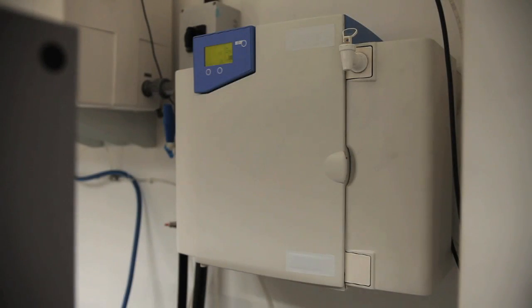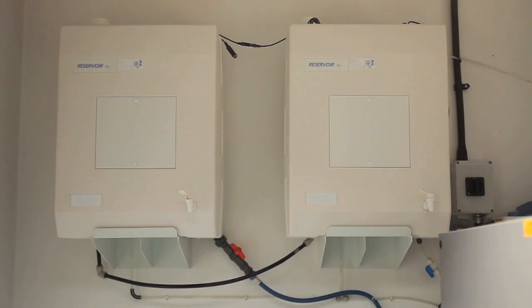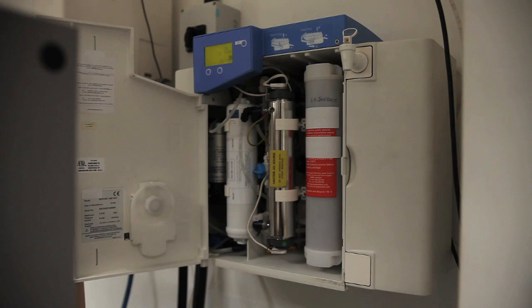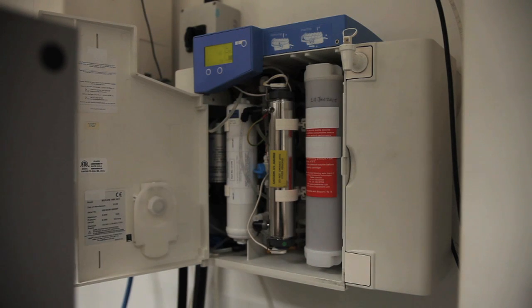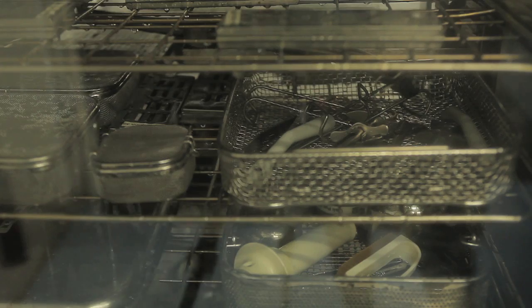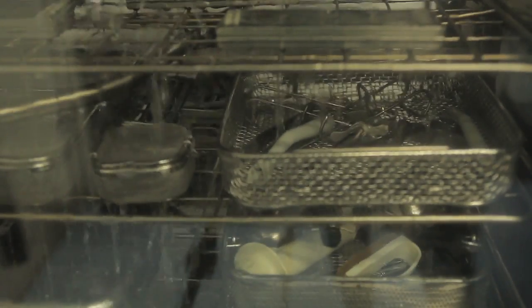RO water is usually generated on-site from a reverse osmosis unit. These units are usually equipped with a water reservoir for short-term storage of RO water. Such reservoirs are often equipped with an ultraviolet light treatment system to minimise microbial growth and multiplication. RO units used to provide RO water for autoclaves and washer disinfectors are normally configured to provide sufficient RO water for the daily demands of the equipment with minimal storage time. The quality of the water used at all stages in the cleaning process is critical to the successful outcome of the process, as the water is the last product to make contact with the RIMD prior to its subsequent use.